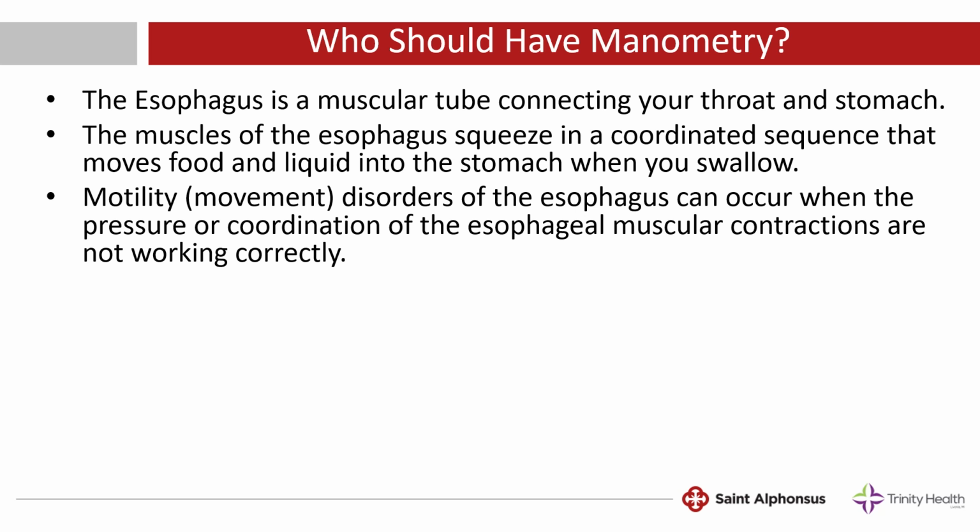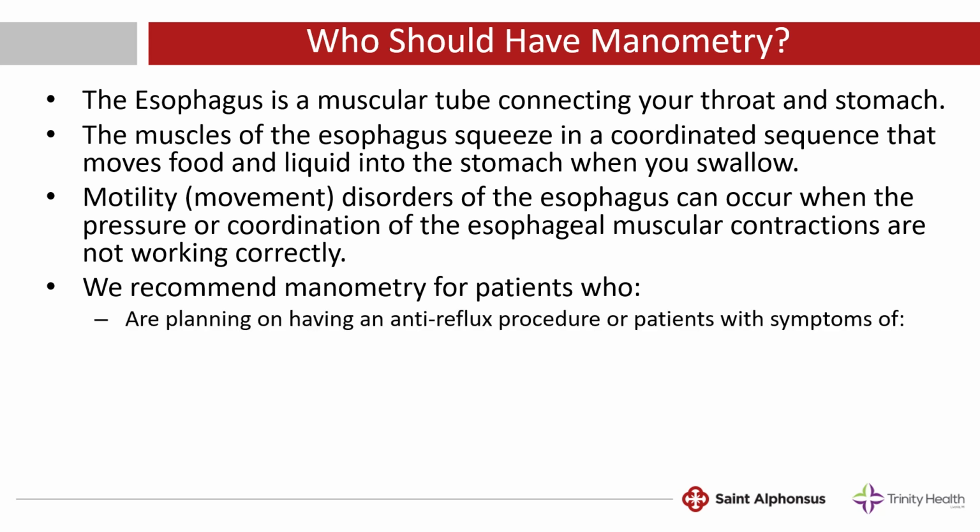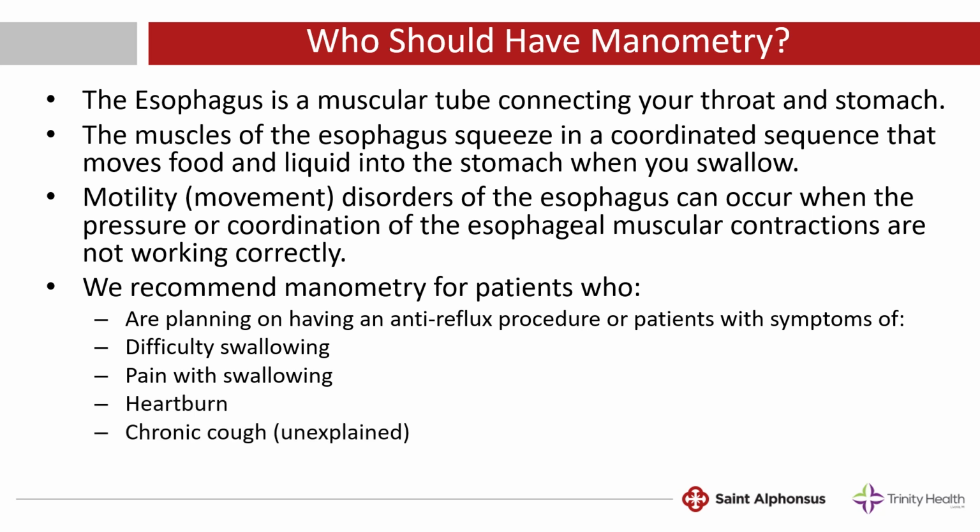correctly. We recommend manometry for patients who are planning on having anti-reflux procedures or patients with symptoms of difficulty swallowing, pain with swallowing, heartburn, chronic cough that's unexplained with other tests, and non-cardiac chest pain.